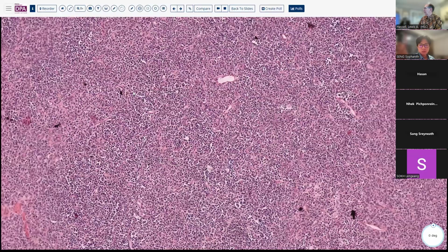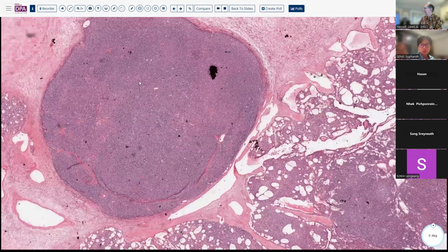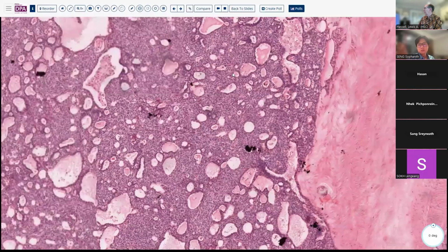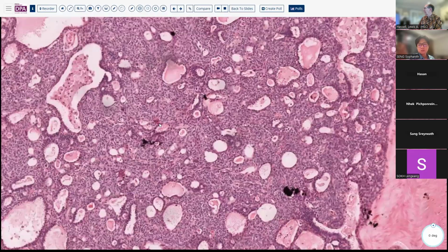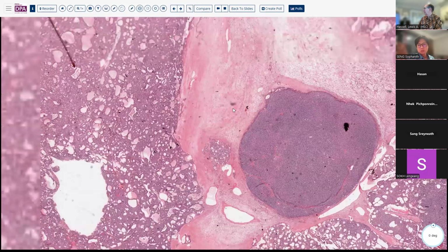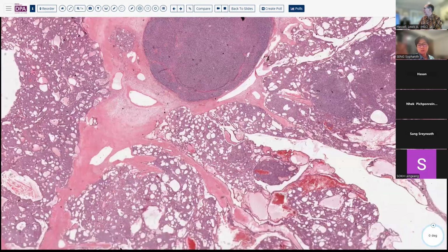So as you can imagine, if you had a needle biopsy that was just this, you might call it a B2 or something like that, or maybe even a B1. Whereas if you had a biopsy that was just showing you this, you might classify it differently. Well, as we've indicated, that significance is not overwrought, is not a huge thing.